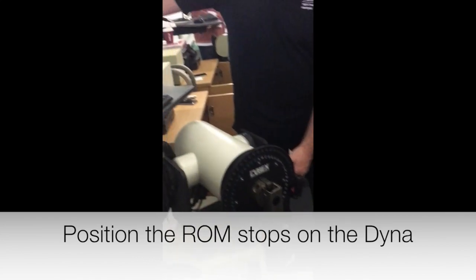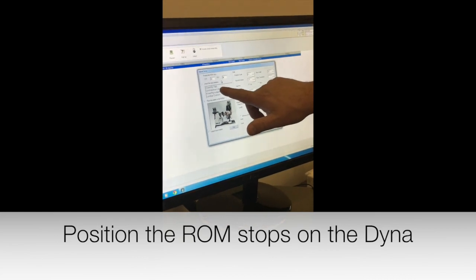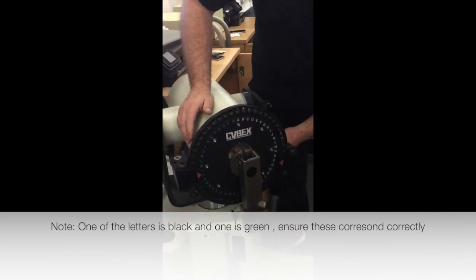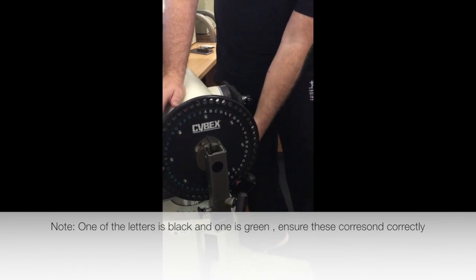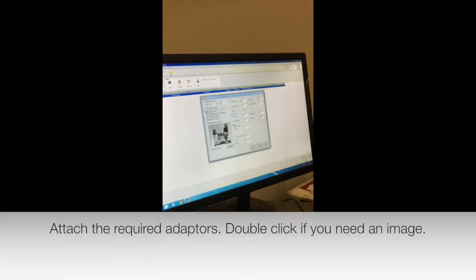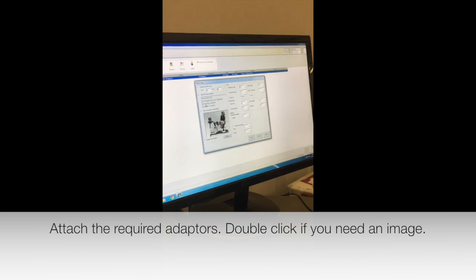Okay, so you'll see that it's a black U and a green N. That should hopefully correspond. And then just set it there. And what was it? U. Like so. So it's just a little pull out and slide. Happy with that? Yep.